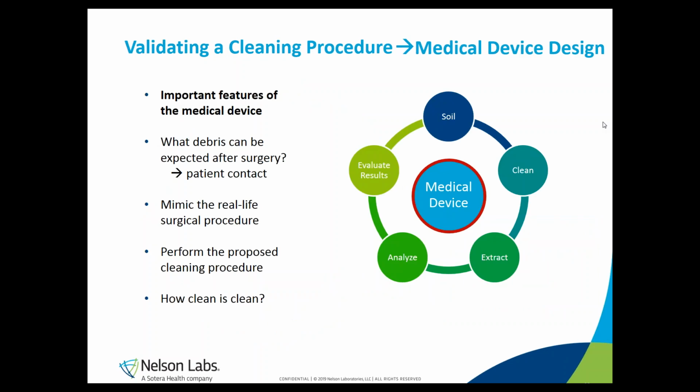When you are designing a cleaning procedure, it is very important to know the exact properties of your medical device itself really well, as they are key in the way a cleaning procedure will be performed later on. On this diagram, you can see the key steps in the validation of a cleaning procedure for reusable medical devices. And these include the design of the device itself, also the way a patient contacts the device when used during a surgical procedure, and also an assessment on how clean your device really is after we have performed the proposed cleaning procedure.